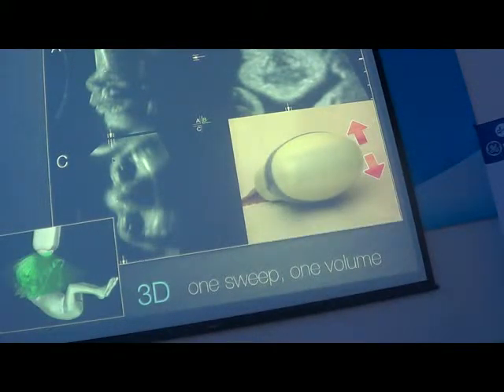And inside the volume you can obtain any section plane, you can move inside. Và từ cái khối 3D được dựng lên đó thì ta có thể chọn ra cái lát cắt mình mong muốn.